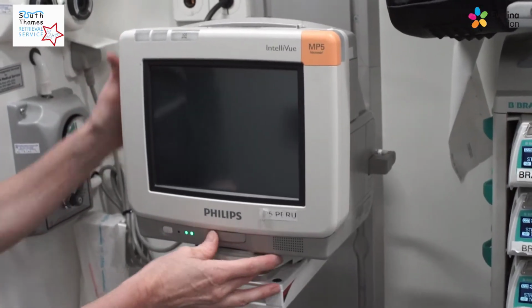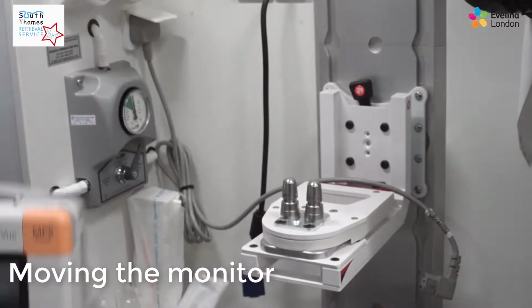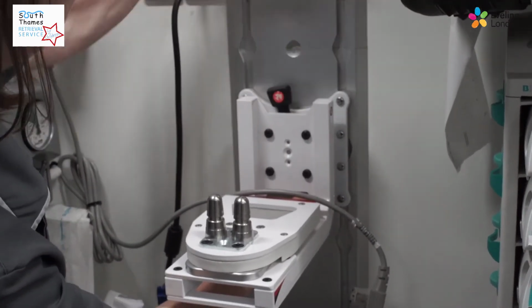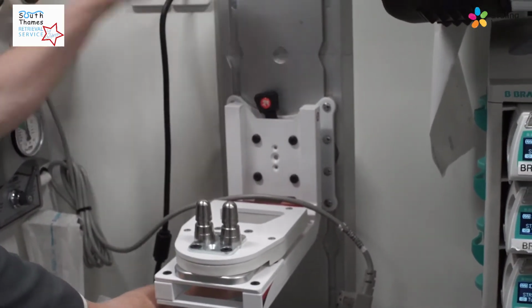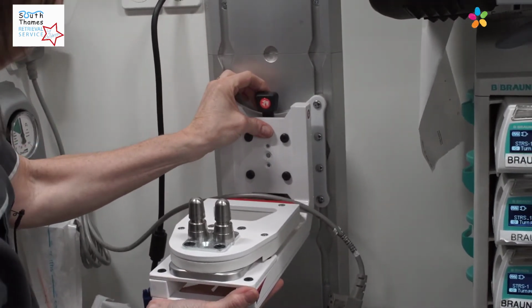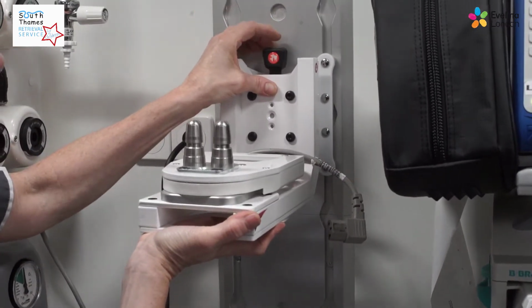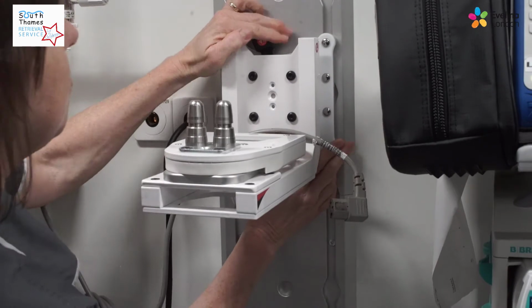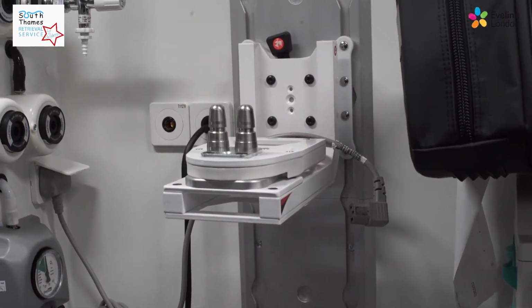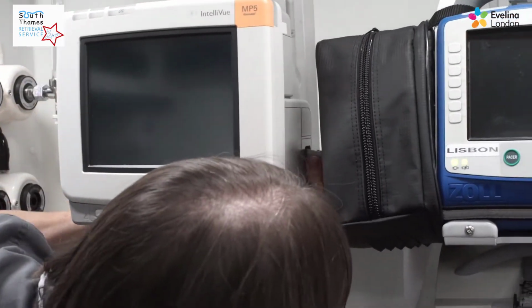So you then need to move the monitor. Disconnect the mains, press the button and lift it off. And then you need to move the monitor bracket up two positions so it's almost level with the oxygen. So put the black lever into the central position, lift it forwards, and as you support it, that's one, that's two. And lock it back by pulling the black lever into a diagonal. Put the monitor back on and make sure you put the lead back in place.